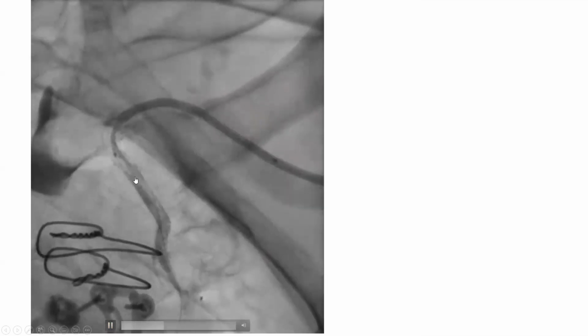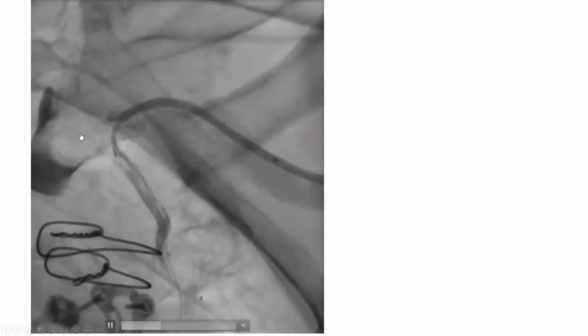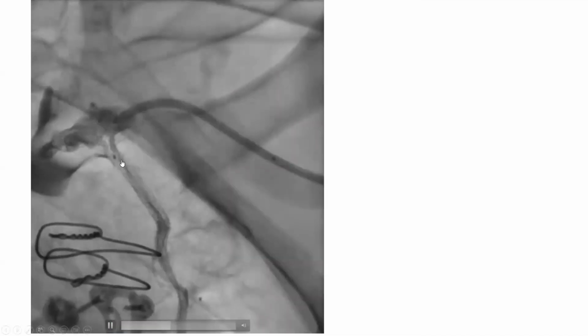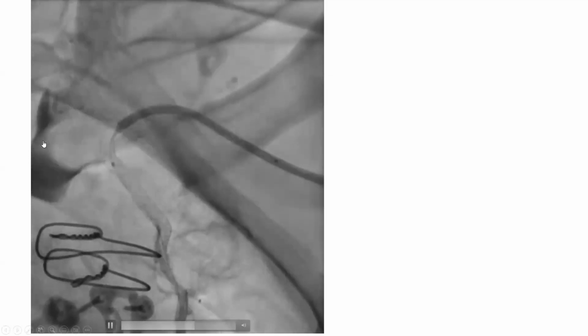After just one stent, we reestablished excellent flow into the LIMA, and you can see that we have no further dye extravasation into the subclavian, proximally or distally. Now we still have the previous dye stain into that hematoma. The hematoma is still there.